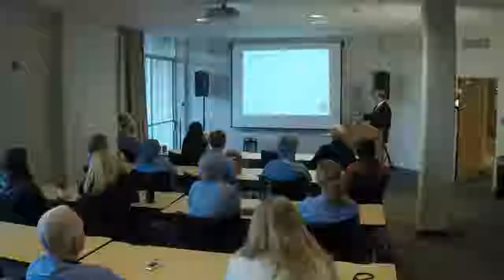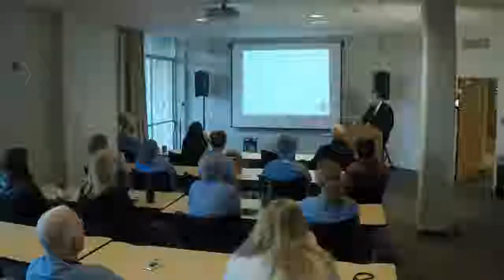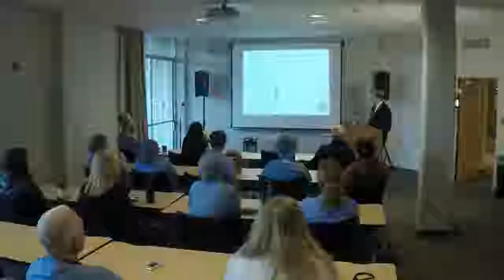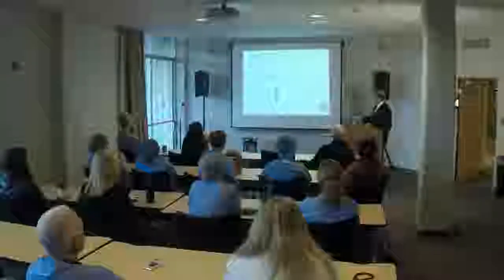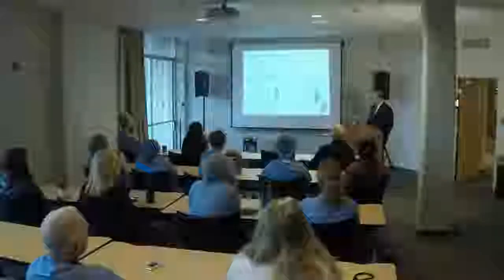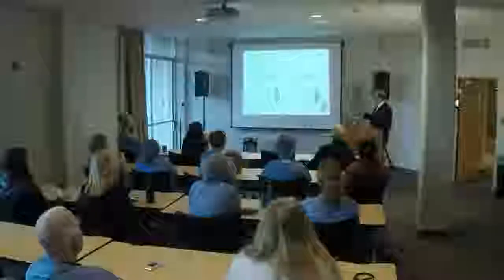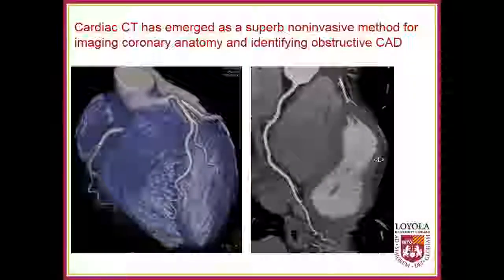So a recent study from Duke University, published in JAMA Cardiology, 15,000 patients, found that patients with a positive stress test were actually the least likely to have obstructive coronary artery disease at the time of their cath. And in fact, those with a positive stress test were the least likely to get revascularized, even compared to those with negative stress tests. Now that brings us to coronary CT.